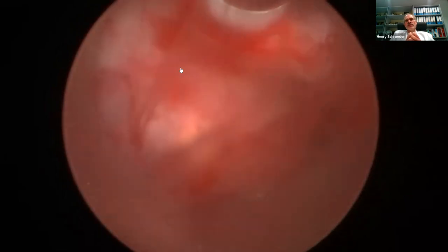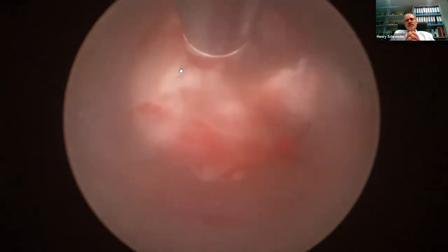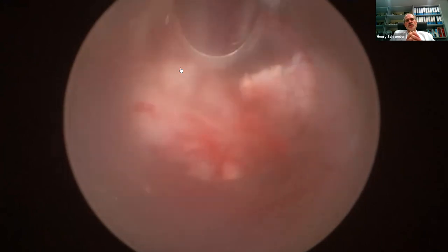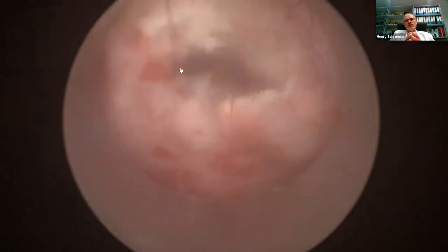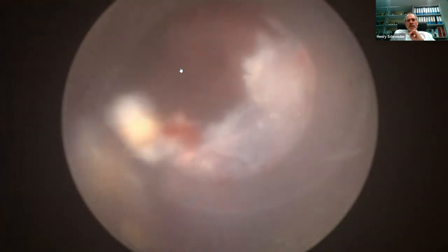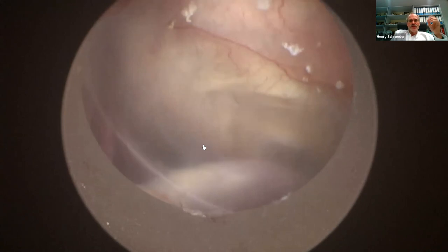And this patient is endocrinologically completely normal. He's 84. So I would never do a radical resection. That's why we choose the transventricular approach. You just want to open the cyst, and then you have seen there's a second cyst compressing the brainstem. So make a wide opening in the first cyst, and then we go with our endoscopic sheath into the second cyst. And you see here's the clivus, here you see the basilar, and here you see the other membrane. This is the second membrane of the cyst, what you have seen on the pre-op image.